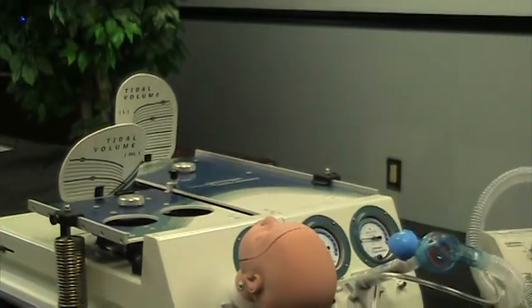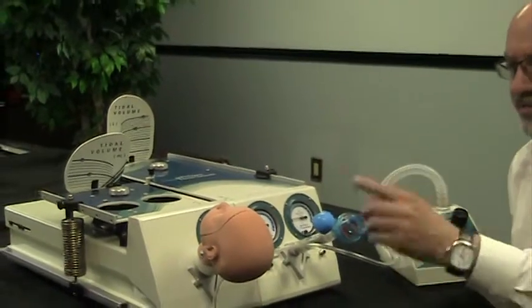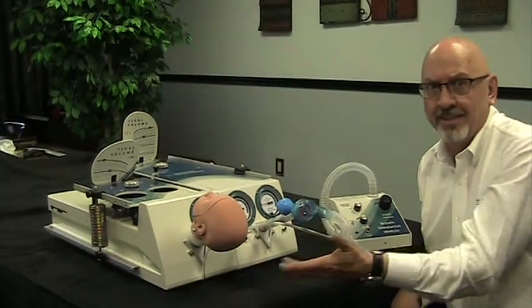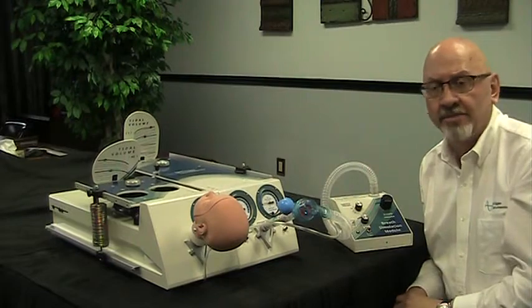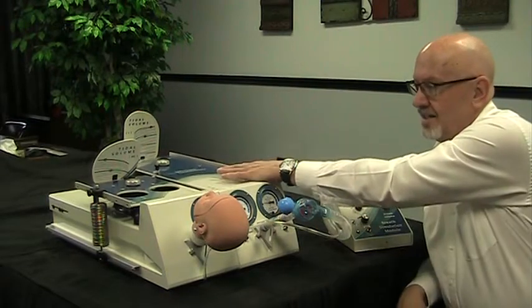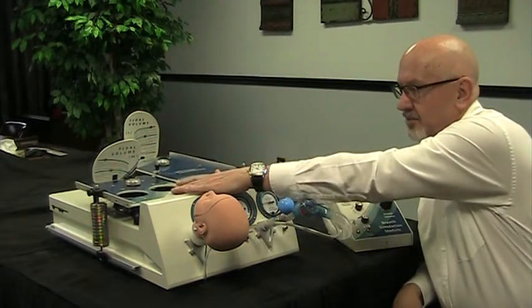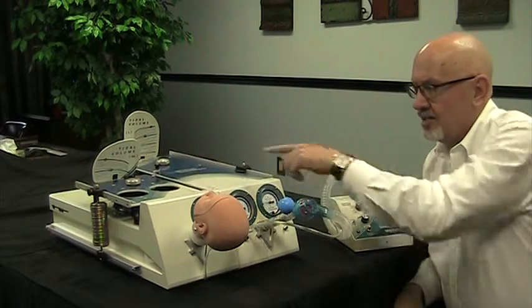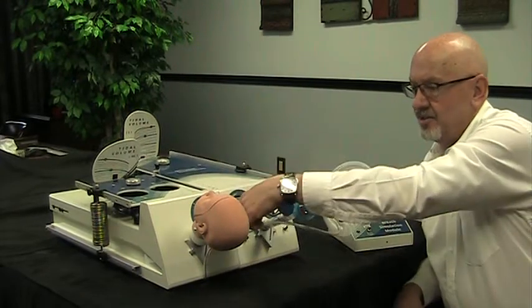Now we do not recommend that you reverse this and try to use the infant lung to lift and drive the adult lung. There's simply too much weight, and the forces required could cause damage to the infant lung or the pressure gauge.